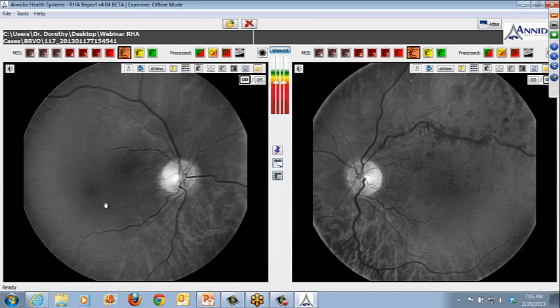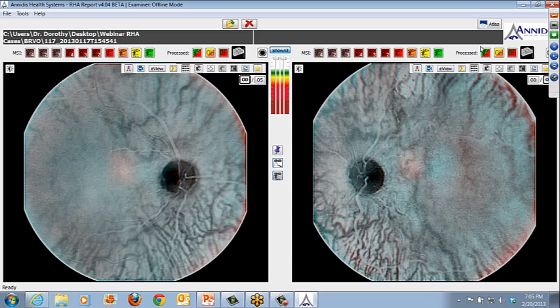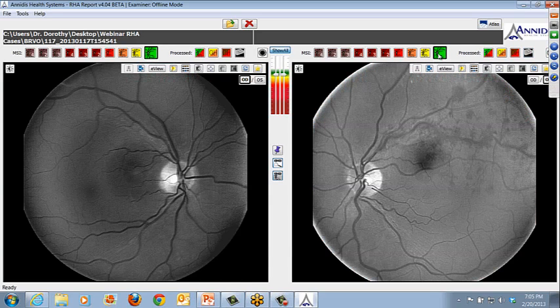Okay, so I want you to primarily take a look at this eye here. And I don't think I need to explain what the pathology here is. I think everybody would easily recognize what this is. And with any retinal vascular occlusion, in this case it's branch retinal or hemiretinal vein occlusion, you're going to see hemorrhages, potentially exudate, and if it's a more ischemic BRVO, you're going to see a broader representation of cotton wool spots.